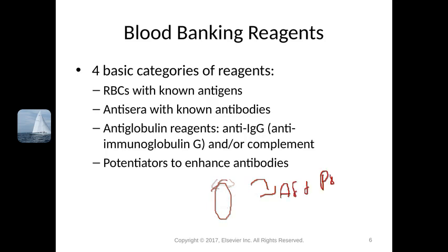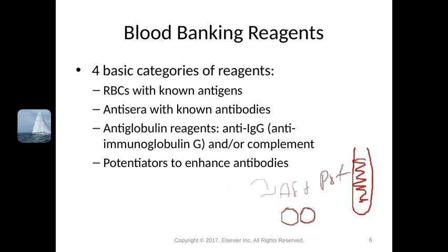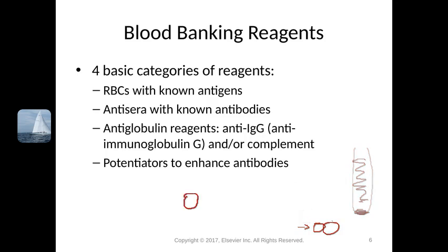Or we spin it, and then we get that cell button where the cells are getting really close together. And then they agglutinate. So the actual agglutination is a lattice of that antibody bridging cells together.